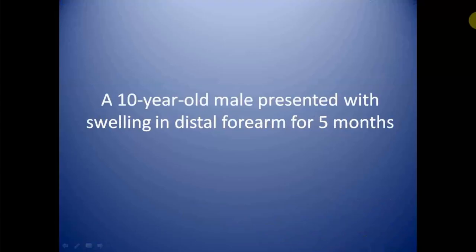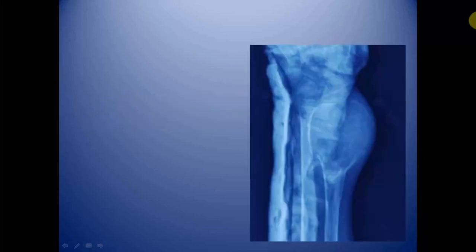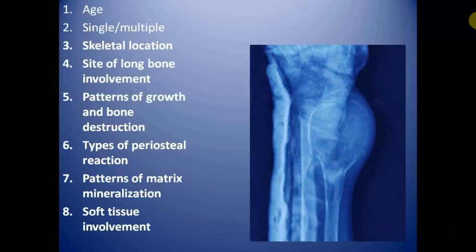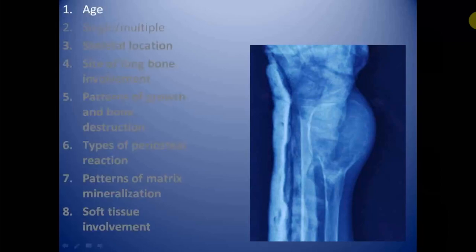This is the case of a 10-year-old male who presented with swelling in the distal forearm for five months. This is the radiograph of the distal forearm and wrist of the patient, which is partly under plaster cast, and we will review this lesion using the same systematic headings.